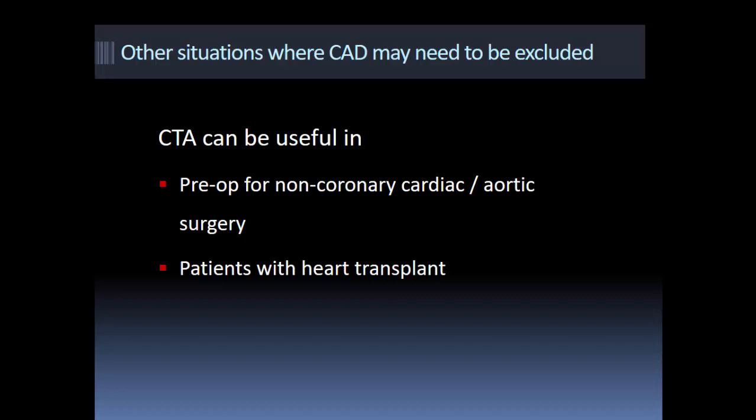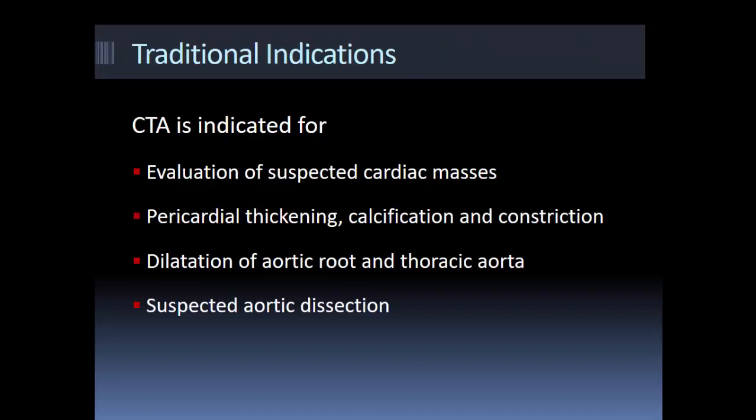Then we are routinely using CT angiography for patients with heart transplant. So in Harefield, we have a large cohort of heart transplant patients. They used to have routine invasive angiography every 1 or 2 years, so they will have it during a lifetime. So now we have replaced invasive angiogram with CT angiograms in this patient cohort. Once we know on CT angiogram that they have 50% or more disease, then we recommend further follow-up with invasive angiogram. But till that time, we are following them up using CT angiography.